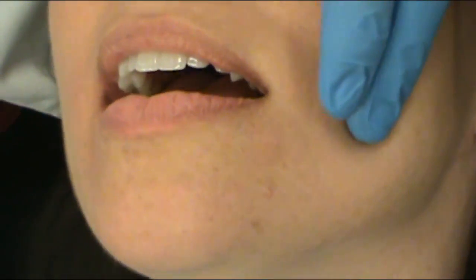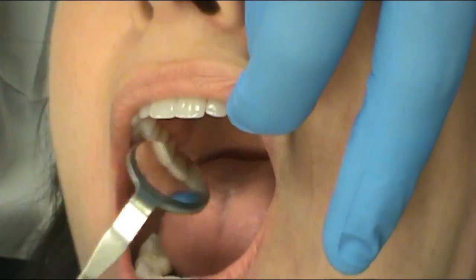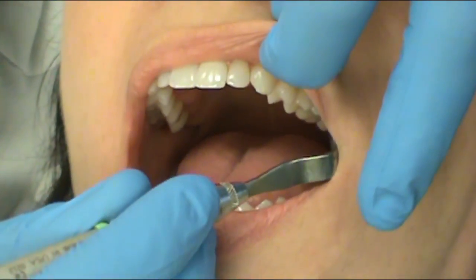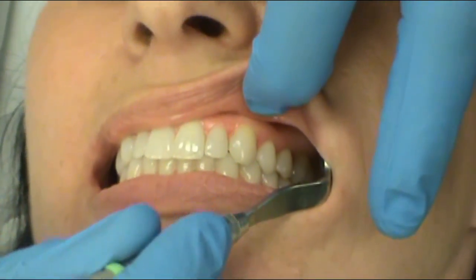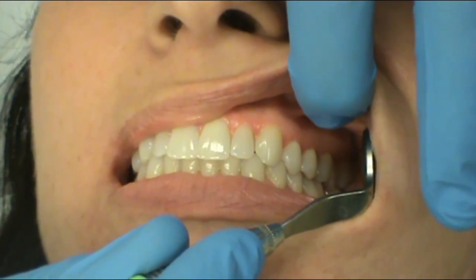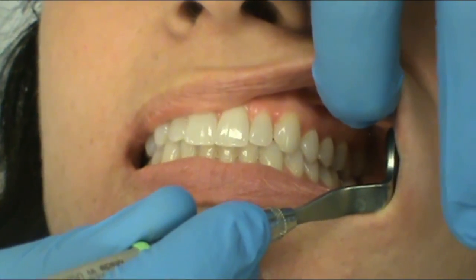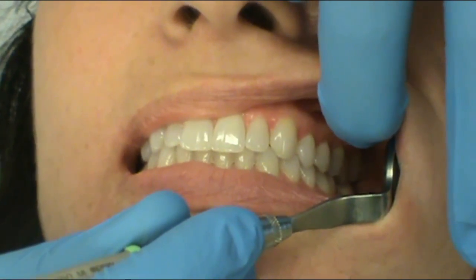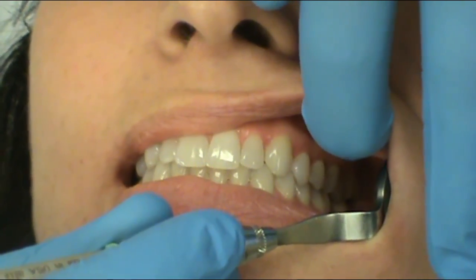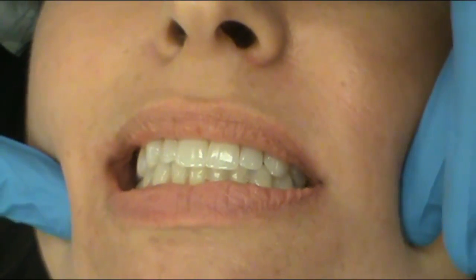Since I'm a right-handed clinician, I'm going to use a mirror to check her occlusion on the left. I'll insert a mirror, retract back her cheek, and have her bite together. Again, I'll look at the mesial buccal cusp of the first molar and how it articulates with the mandibular first molar. Her buccal cusp is sitting right in the buccal groove of the mandibular first molar, so she has bilateral class one occlusion, both right and left.